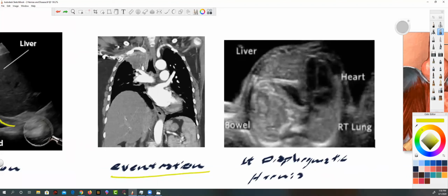But so paralysis is possible. I have had plenty of patients that I wonder if they did have paralysis. When we have patients take a deep breath in and hold it, the reason is almost every organ in the abdominal cavity moves down when they take a deep breath in, because that's what the diaphragm does. It moves down, and all the organs have to go down to make room for the diaphragm. You will have patients you ask to take a deep breath in, their chest moves up, their chest goes out, but the diaphragm doesn't move at all. And so I don't diagnose anything. I might mention to the doctor, inspiration was unhelpful.